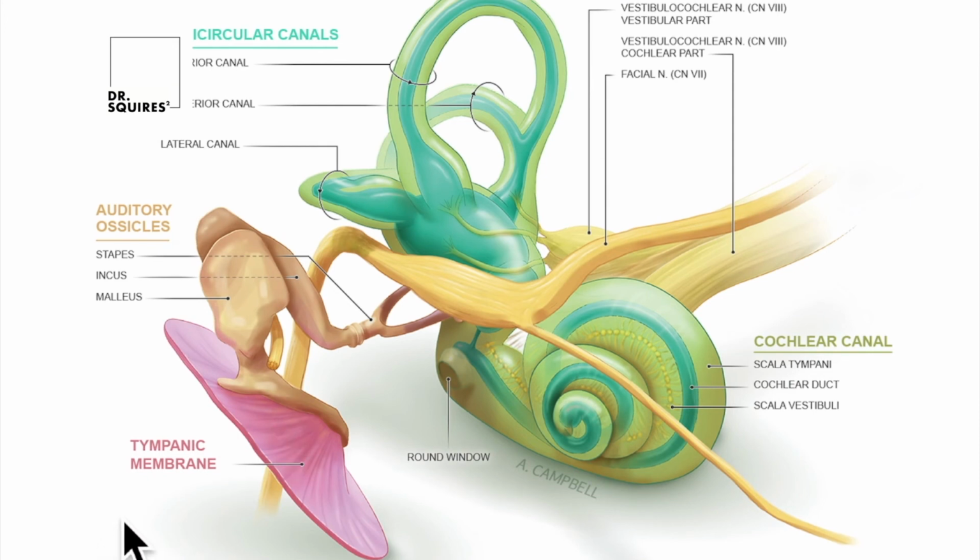It's important to remember the distortion product otoacoustic emission does not give us any information about hearing sensitivity. It's merely a measurement of outer hair cell function or cochlear health. If somebody has a mild hearing loss, they may still have these responses. And conversely, if somebody has normal hearing that doesn't show up on our standard hearing test, they might not have any responses. So like Carly said in our last video, it is a tool in our toolbox that we can use to reinforce some of the information that we've gotten on our other tests.